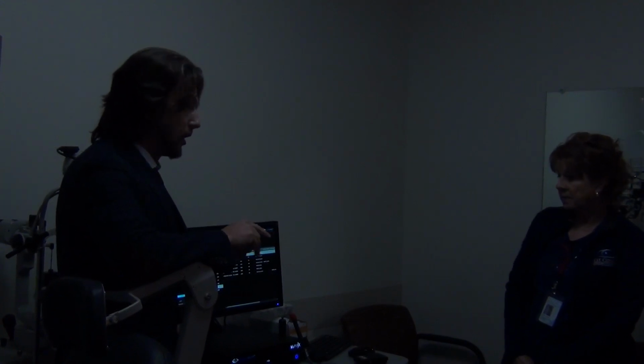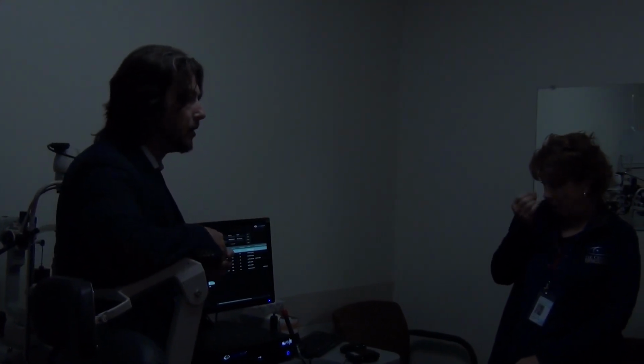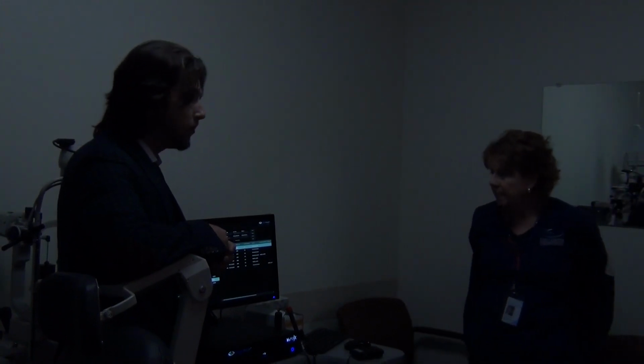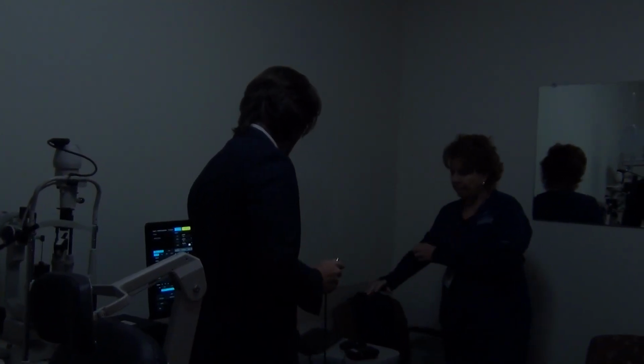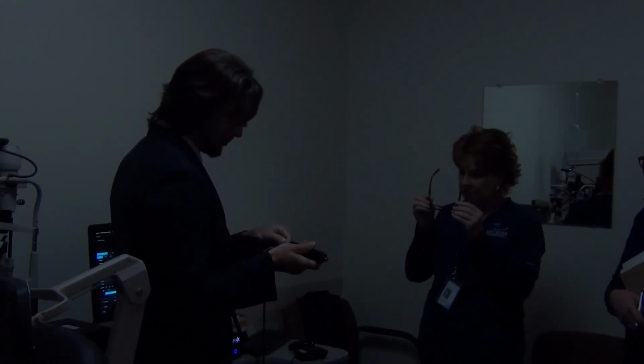Between the transducer and the eye, any extra layer will affect the picture quality. I'd rather stay away from the clear skin covers if we can do it without, and we can learn it without. They're crazy amounts of expensive. They are very pricey, yes. Dr. Prager charges a very significant amount for them, and it's probably not the best solution because they're single use.